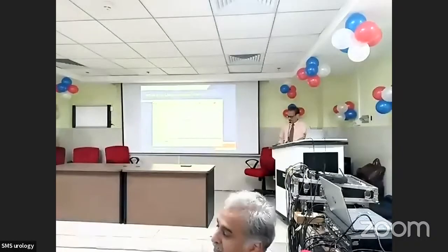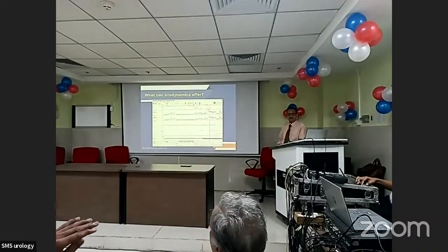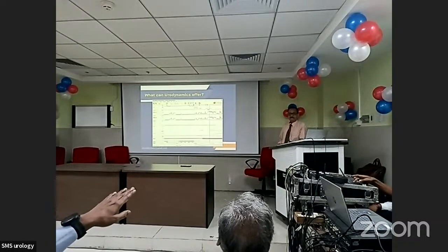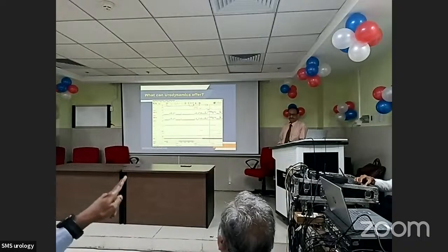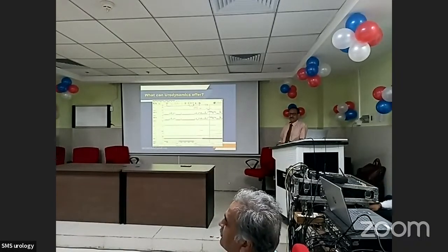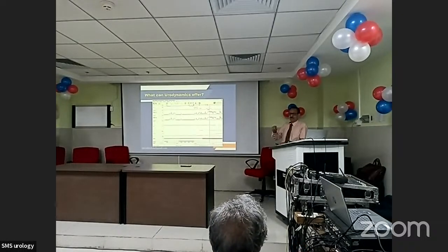Another question we are discussing is DSD. In DSD, we don't see a rise in abdominal pressure. It's just detrusor pressure rising at the same time EMG activity is rising. You see this in neurologically abnormal patients, where the entire micturition reflex is disrupted.